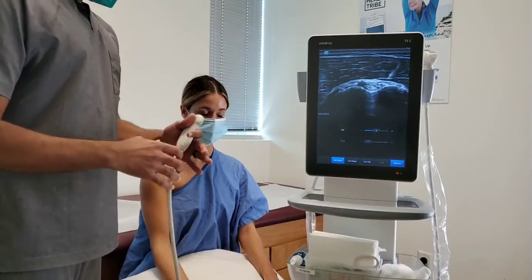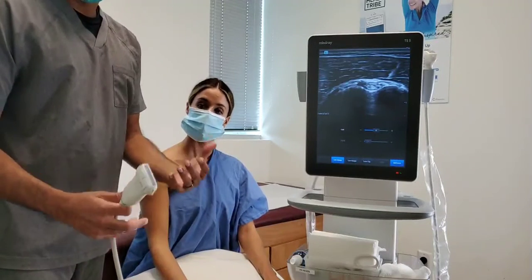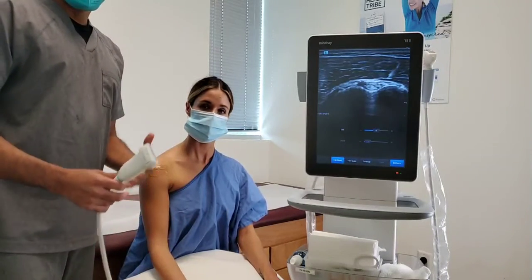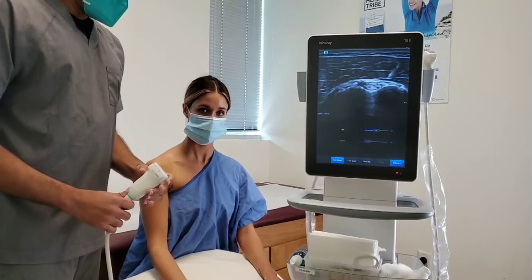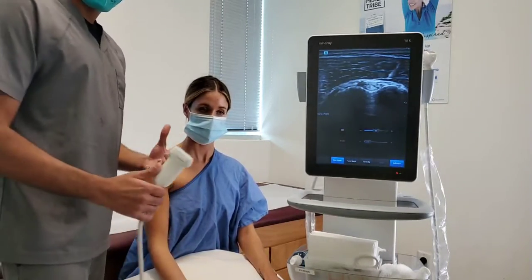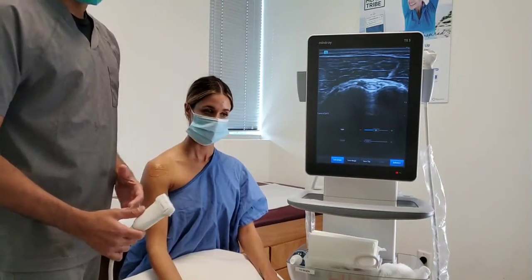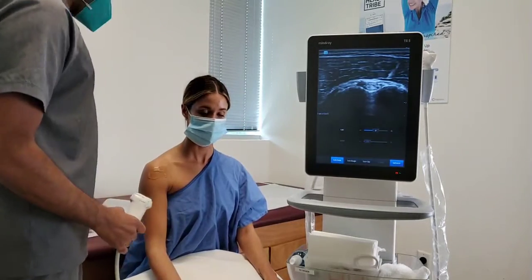So I've been taught that ultrasound is ultimately an extension of your physical examination. So I would start with doing a thorough physical examination, the type that we did last week on our Facebook Live and what we posted. And based off of that physical examination, I may alter the diagnostic ultrasound in one way, shape, or form. But I'm just going to go over the general structures that we're able to visualize with the ultrasound today.